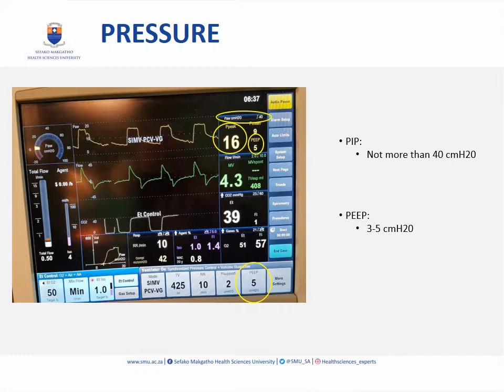Okay. You can use PEEP in patients with asthma or COPD, and it may actually help to improve ventilation because it will splint the small airways a little bit and decrease air trapping by allowing more complete exhalation. But this should obviously be done with extreme caution so as to prevent barotrauma to the lungs. So if it's something that you're not sure about, rather get somebody more experienced to help you with setting the PEEP.